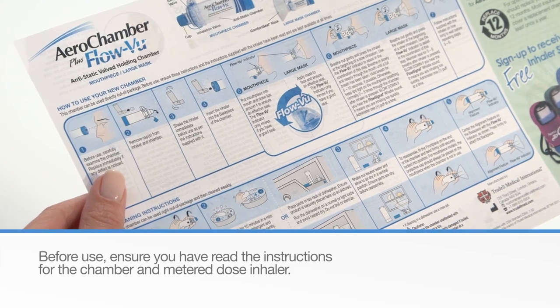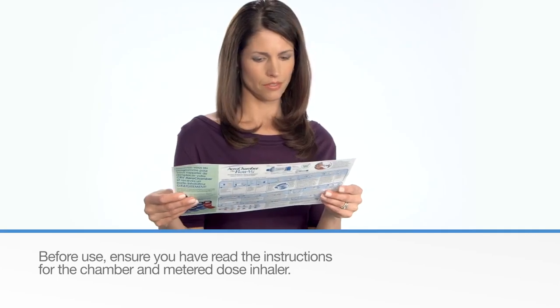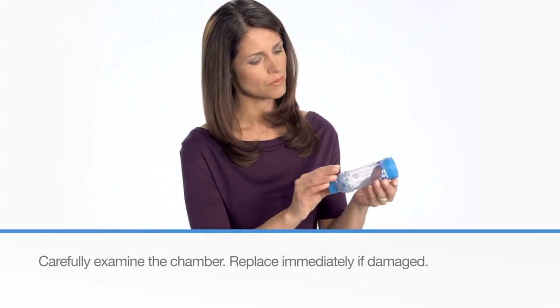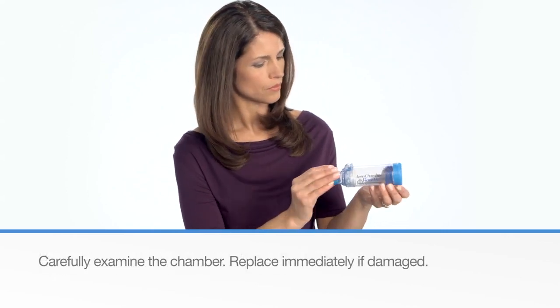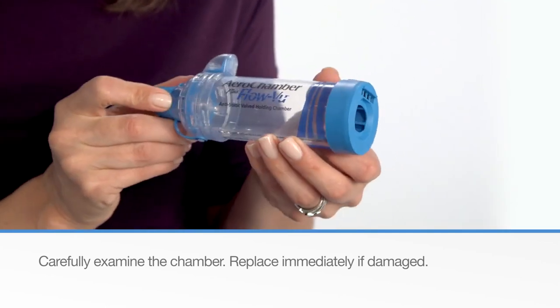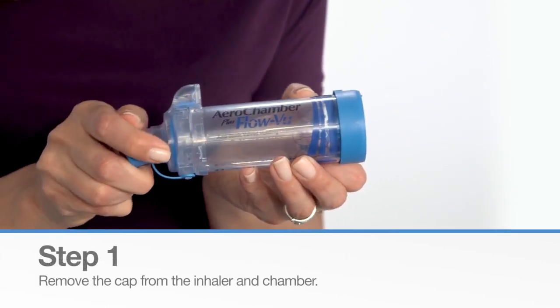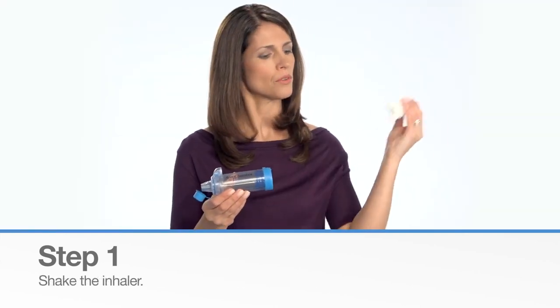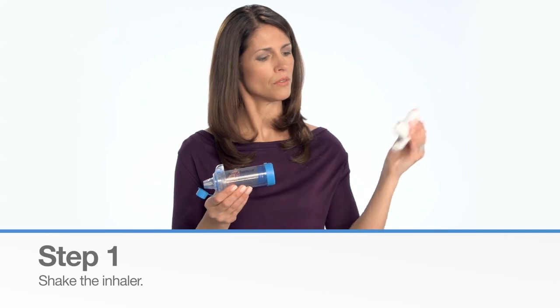Before use, ensure you have read the instructions for the chamber and metered dose inhaler. First, look at the chamber and make sure it is not damaged. If it is damaged, replace it immediately. Remove the caps from the inhaler and the chamber. Shake the inhaler as per its provided instructions.